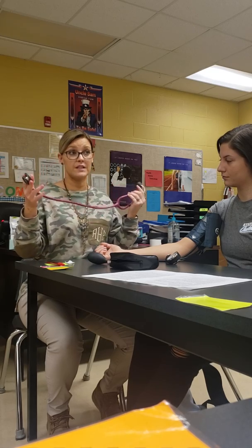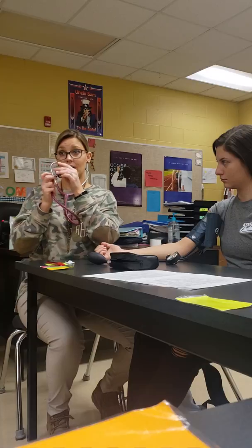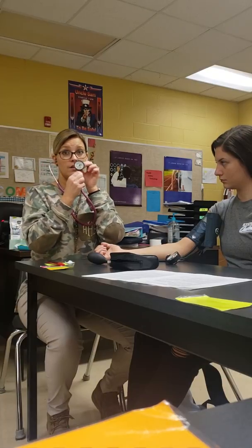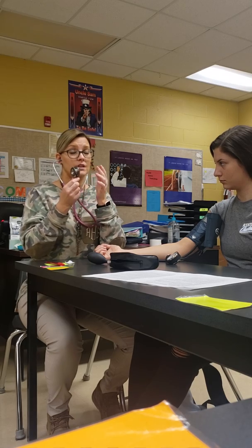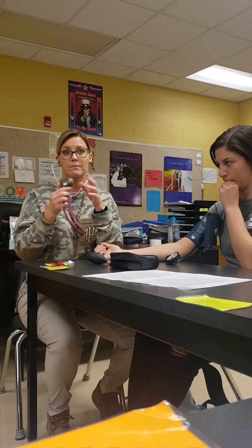So I prefer to hold it this way. Make sure that you're pressing down. Also, before you put the stethoscope on the arm, tap this side and tap this side and see which one's louder. If this side is louder than this side, you need to turn the diaphragm of the stethoscope. I had a student in my afternoon class whose was turned backwards and they couldn't hear anything. So make sure that it's on the right side.